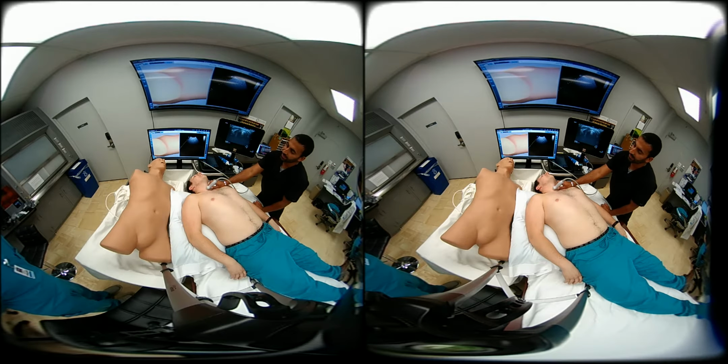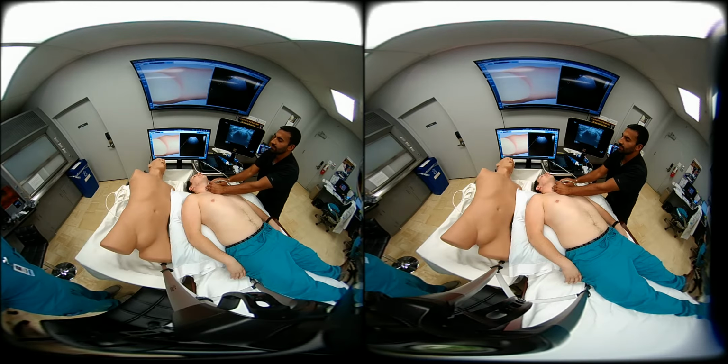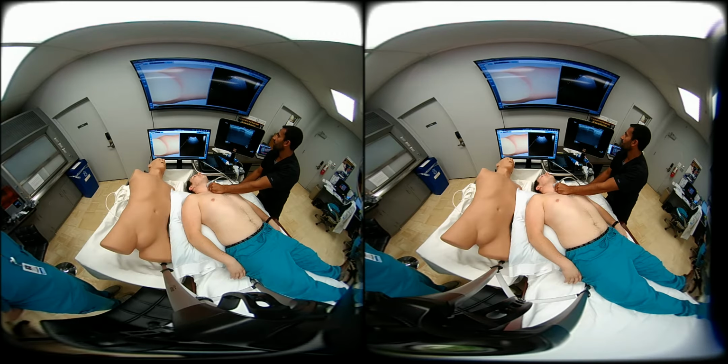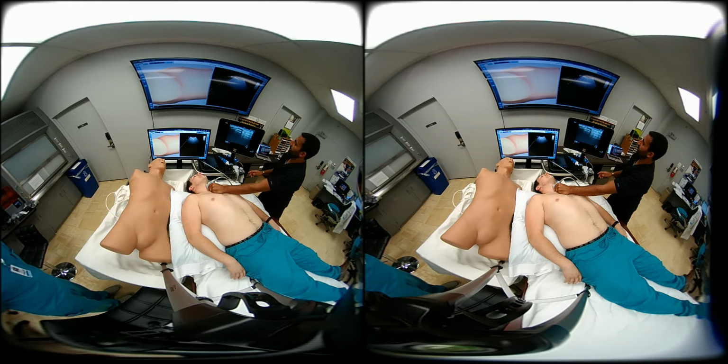But a helpful technique is to get a long axis view so you can see all the airway anatomy in the same image. So I would encourage you to start off about 2 centimeters from the sternal notch, and now rotate your probe such that the indicator is at the 12 o'clock position. Find some strategy to stabilize your hand because you'll find it very easy to rock away from the trachea itself, and keeping it midline is a little bit tricky, but if you rest your hand on your patient, that will provide the stability needed.